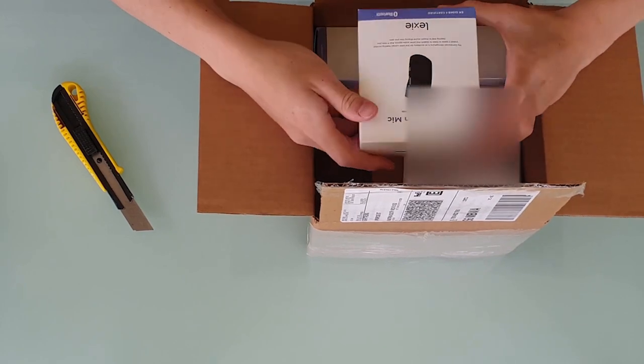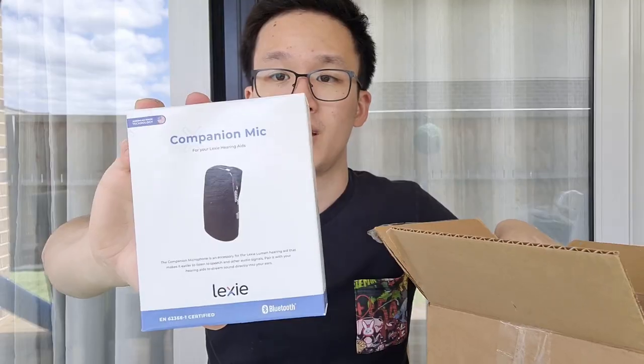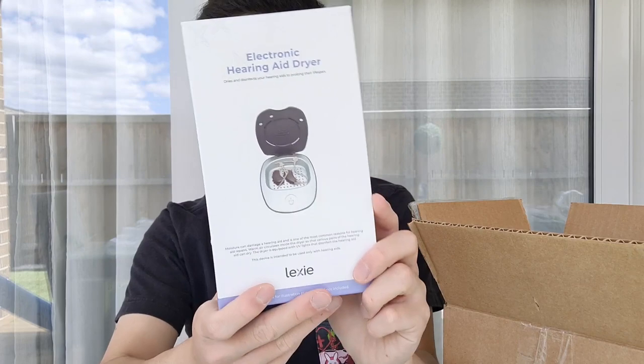So they've sent me a number of things. They sent me the companion mic and the electronic hearing aid dryer.